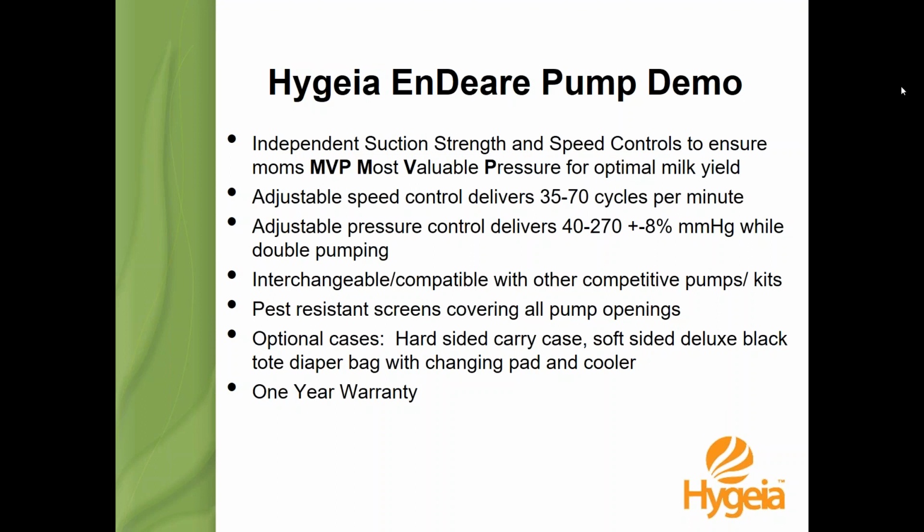So this is our personal accessory set. Hold it up here. It's the Universal Deluxe, and the number down here is the 20-0075. Okay. So based on this one kit, we'll work with all of our pumps and the Lactina.